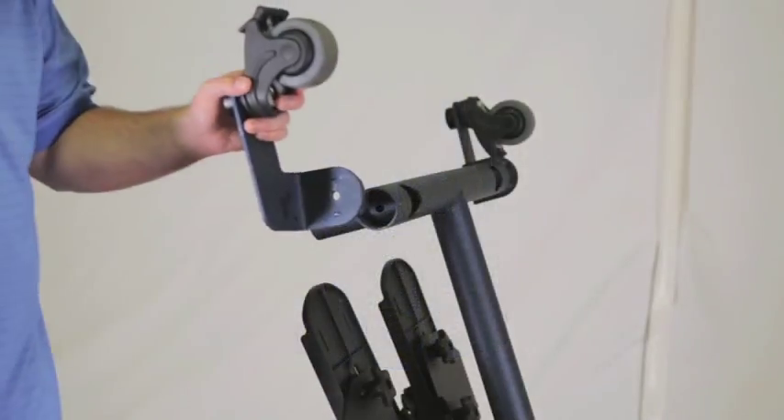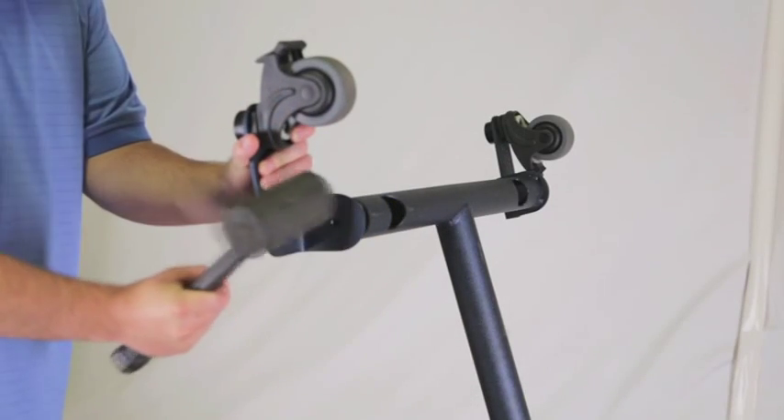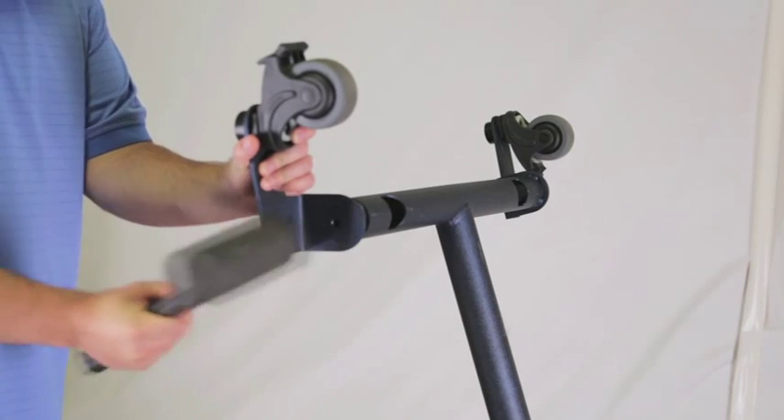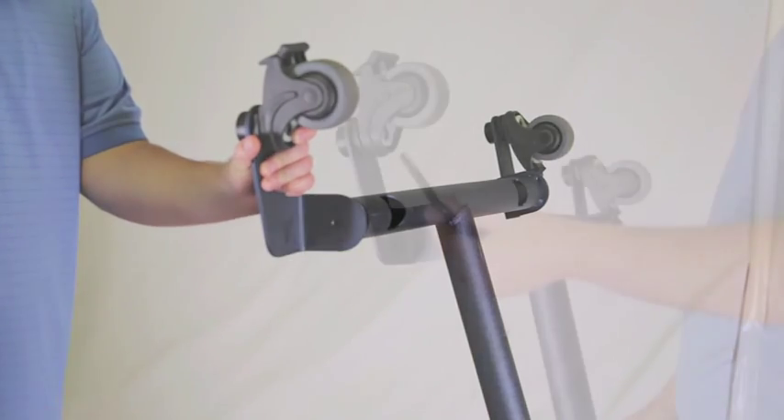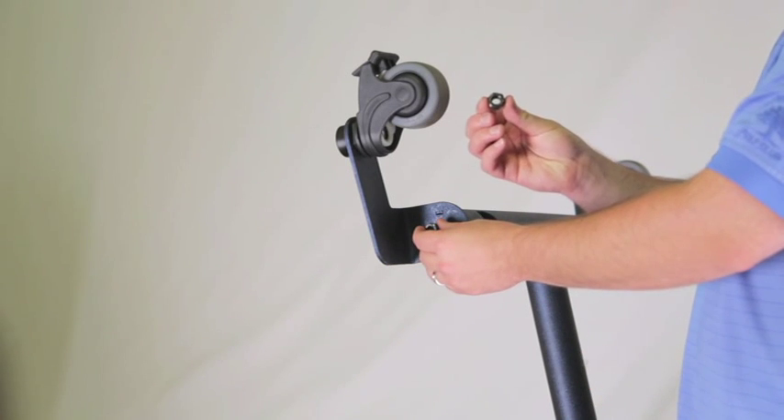If the swing-away front was ordered, place the caster assembly onto the wheel assembly as shown with the casters pointing up. You may need a rubber mallet to help assist the caster assembly into the wheel assembly. Insert the bolt into the assembly.